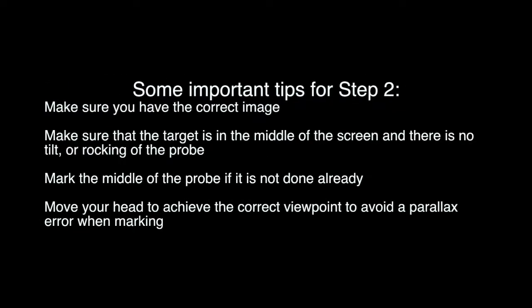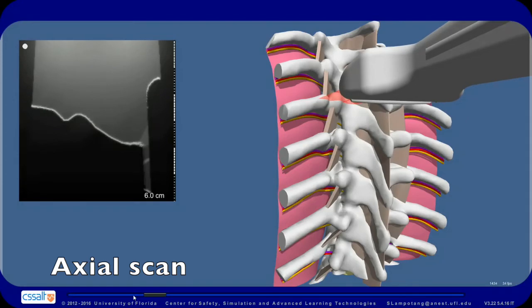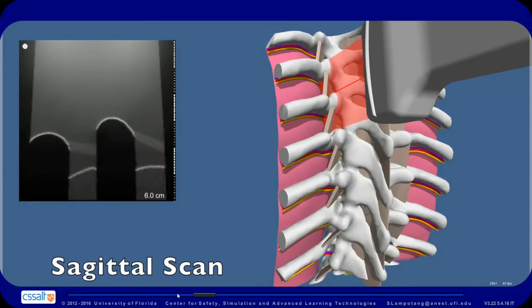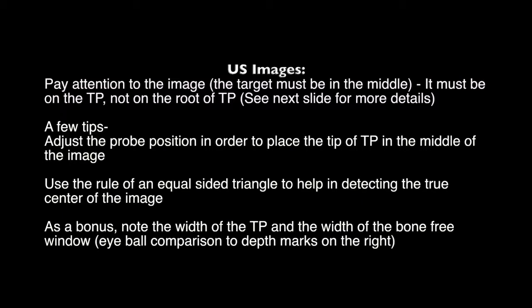Some important tips for step 2: Make sure you have the correct image. Make sure that the target is in the middle of the screen and there is no tilt or rocking of the probe. Mark the middle of the probe if it is not done already. Move your head to achieve the correct viewpoint to avoid a parallax error when marking. When looking at ultrasound images, pay attention — the image must be on the TP and not on the root of the TP.